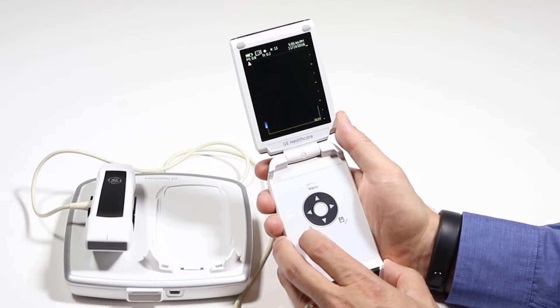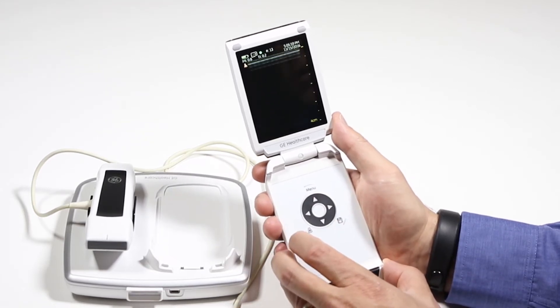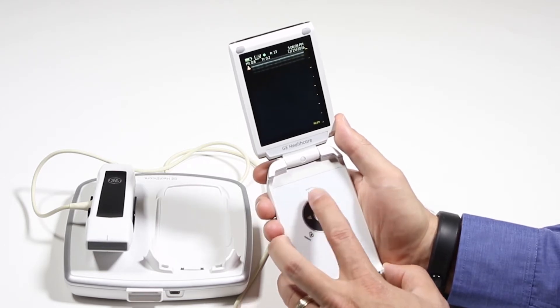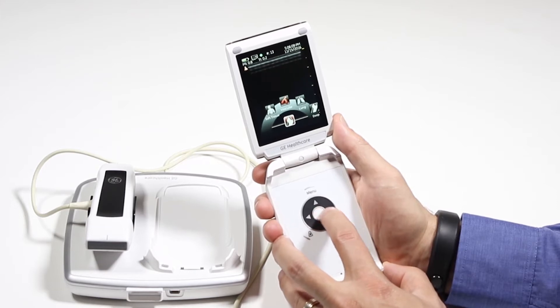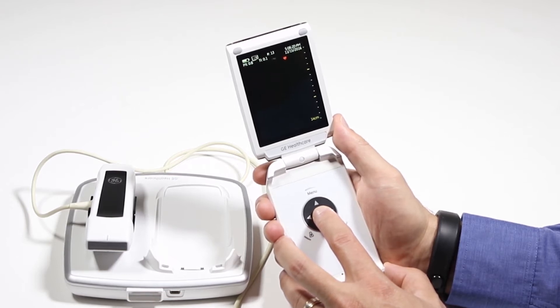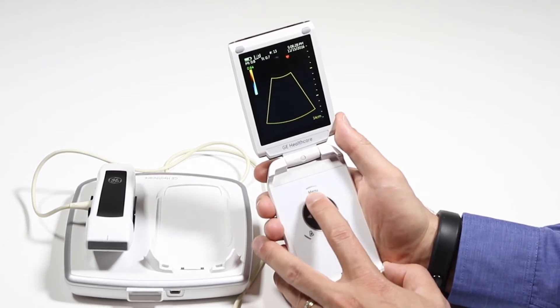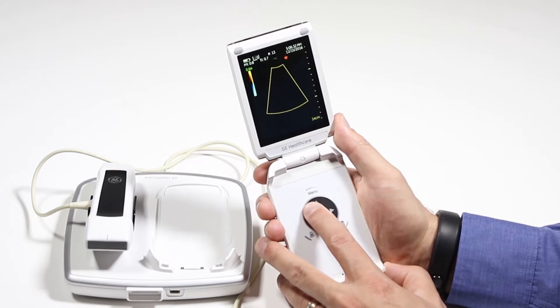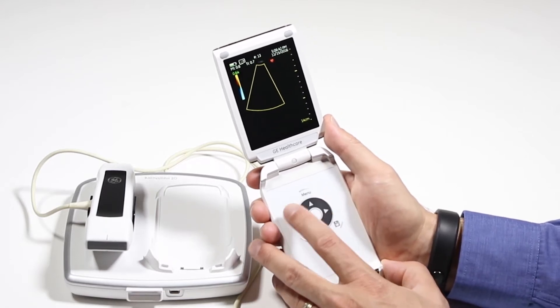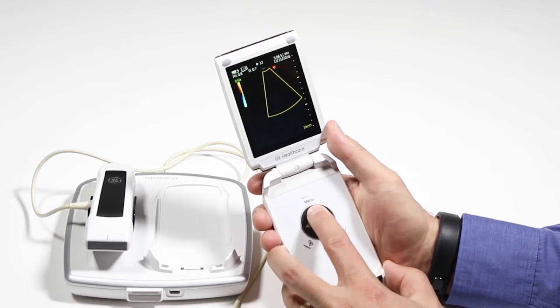When we go to color and have our color box, we change the color gain by spinning here. Now in color with the linear versus the sector or deep probe, there are two different things. For the sector probe, you use the buttons to move the region of interest box around, whereas on the linear probe, going left and right steers the color box, and up and down changes the depth. On the sector probe, these buttons work slightly differently, but you still spin to increase or decrease the gain.